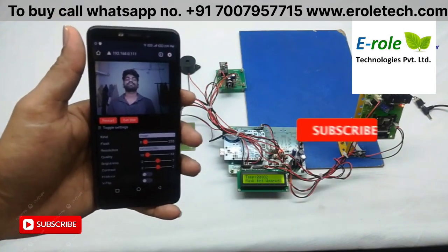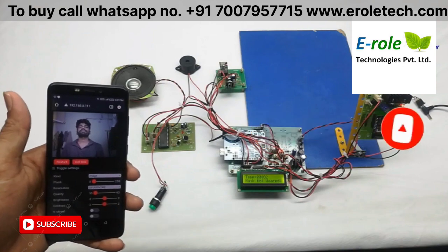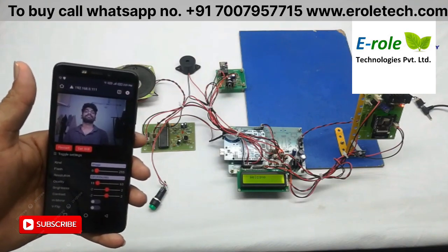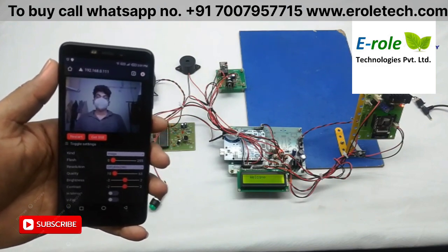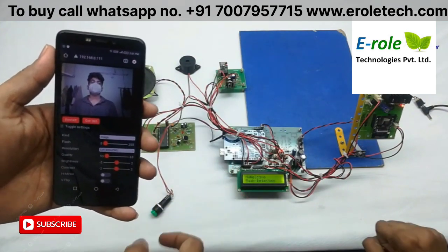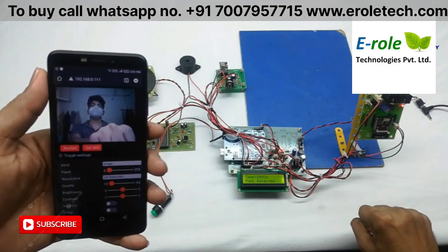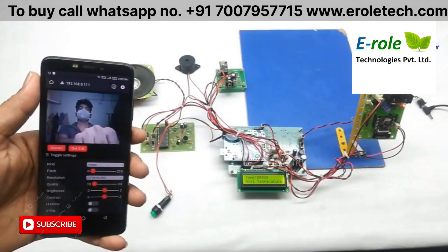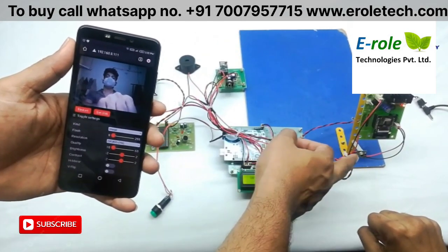According to the server. And the second condition is with mask in normal temperature. Again we have to press this. You can go. Here we have maintained a 15 cm distance from the temperature sensor.